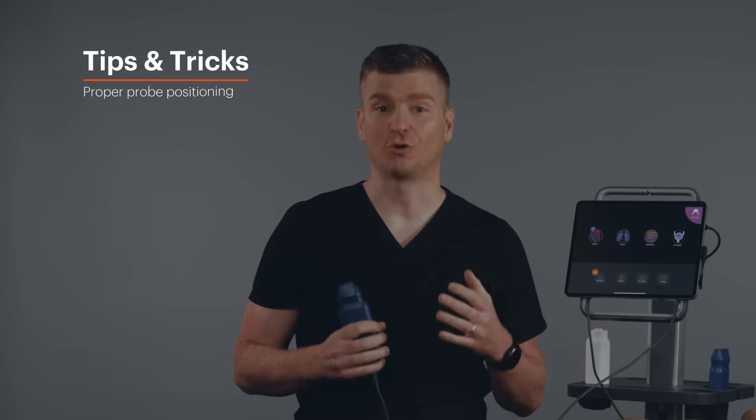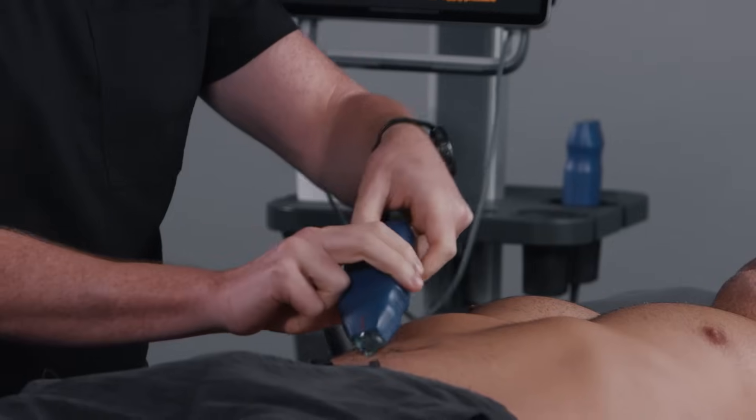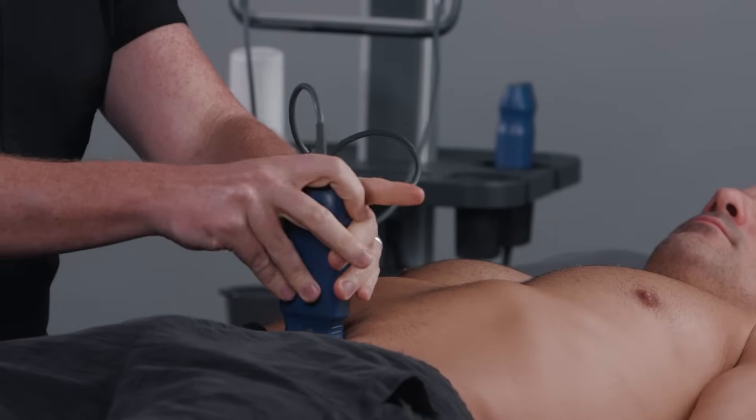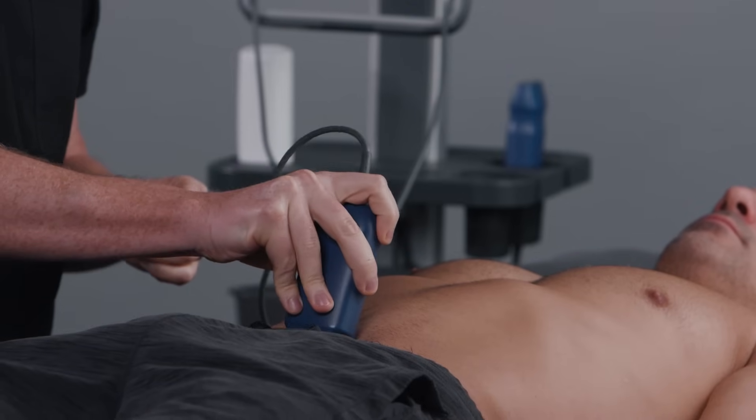The key to getting a great scan involves correct probe positioning and handling. Make sure the probe is positioned low enough on the patient — the probe should sit just above the pubic bone. Angle the probe down towards the feet and use firm downward pressure with enough ultrasound gel.